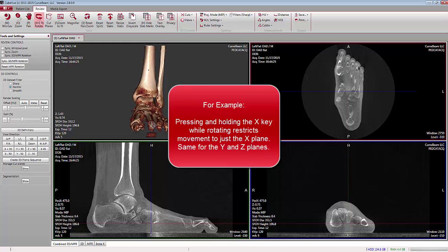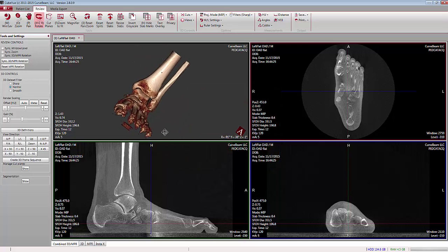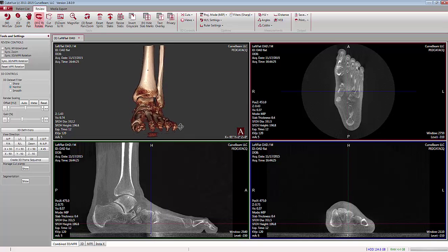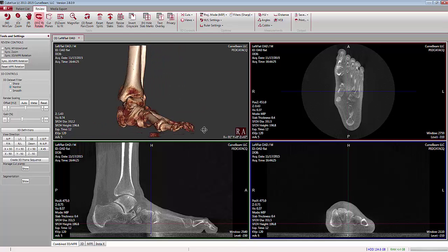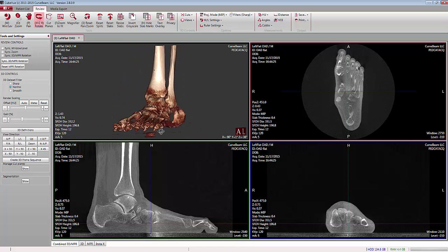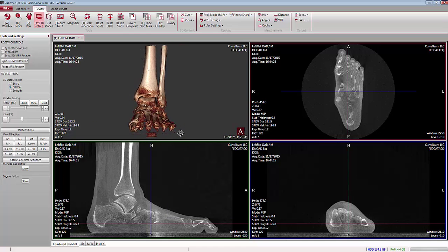Pressing the Y key will only allow a clockwise or counter-clockwise rotation as facing from your observation point, and pressing the Z button will only allow you to rotate in a clockwise or counter-clockwise rotation if you are looking from the top down.